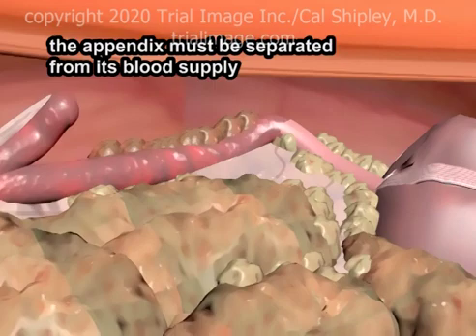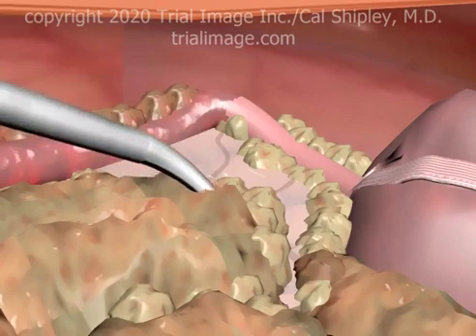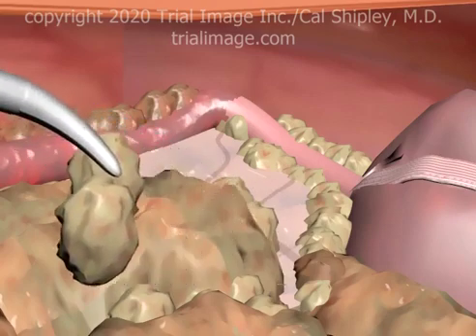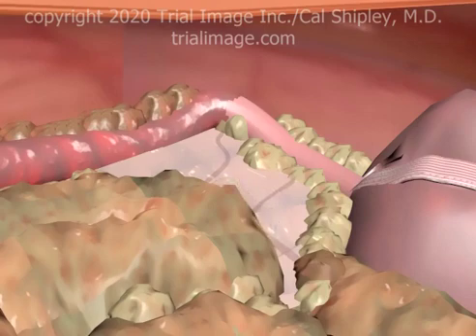Having identified and exposed the appendix, the next step is to separate the appendix from its blood supply. In order to accomplish this, it is necessary to fully expose the mesoappendix, which carries the appendiceal artery and its tributaries.